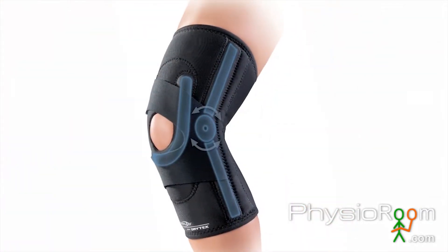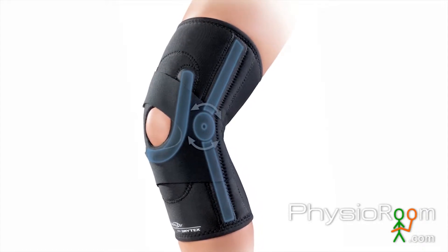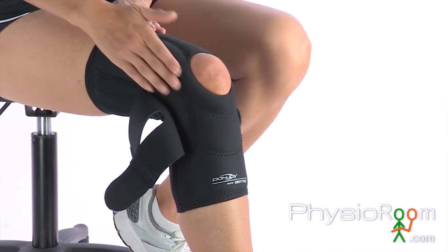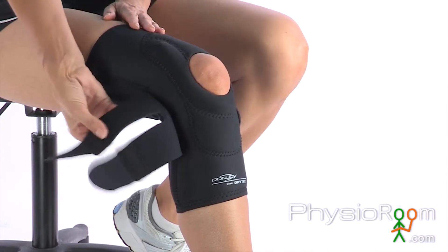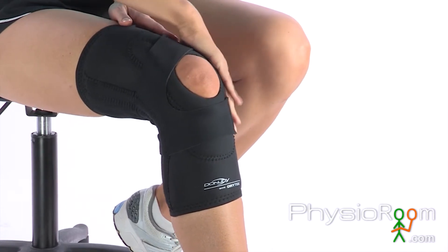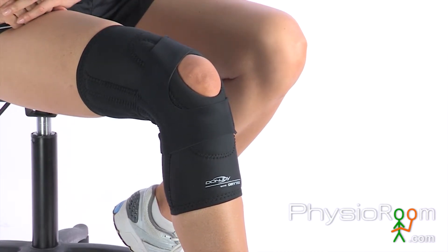The advanced design of the Donjoy Lateral J offers several advantages over a basic knee sleeve. The soft tubular J-shaped buttress lies against the patella, while the lateral to medial strapping helps hold the J buttress along the side of the knee for additional stabilization and proper patella tracking.